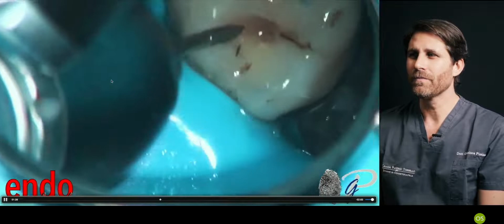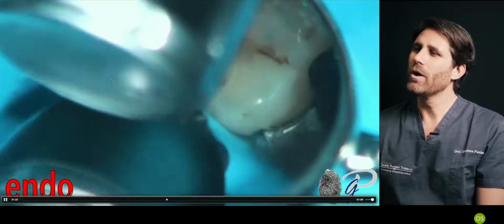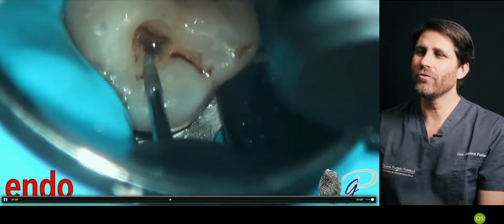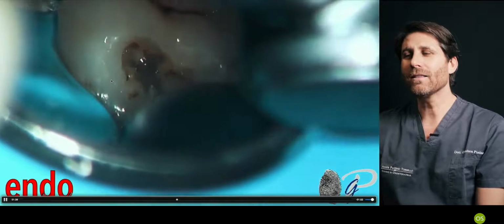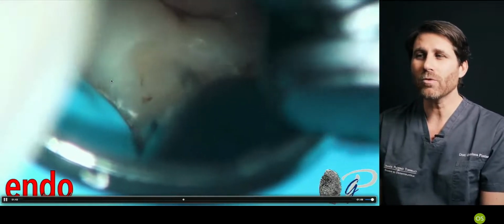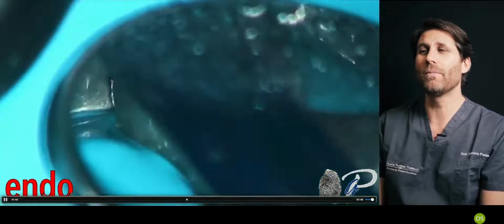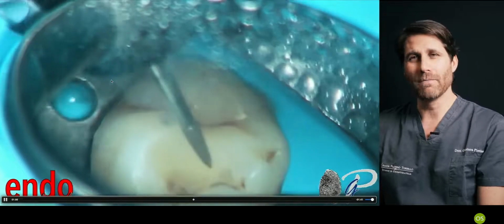part of the tooth. So just refine the occlusal surface to remove the interferences, to remove the undermined enamel, just refine the dentin that creates interference to our instrument, but do not make a predefined shape of an access cavity. Just open it small at the beginning.